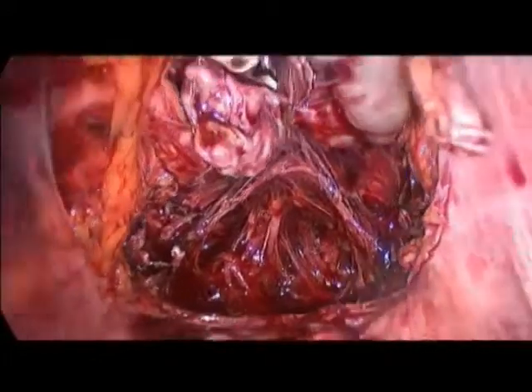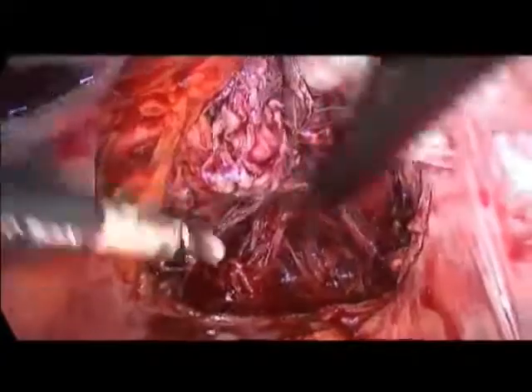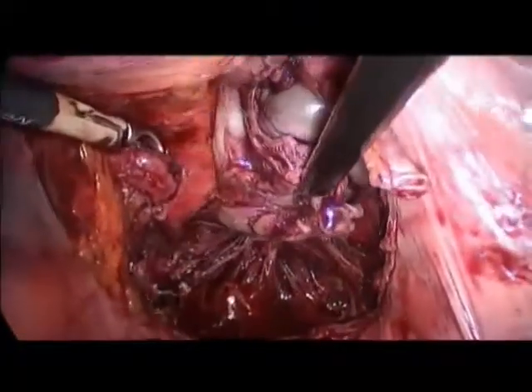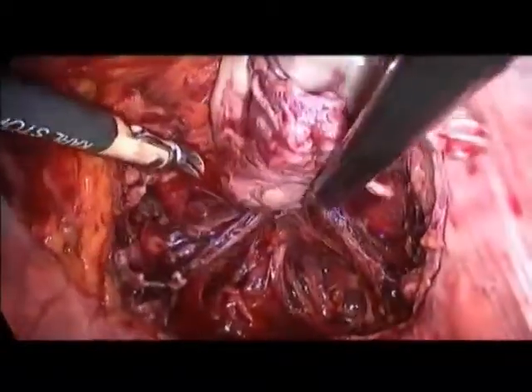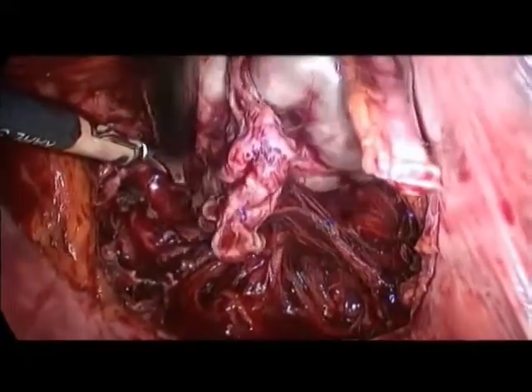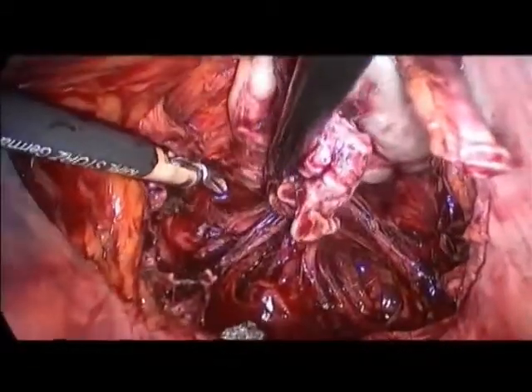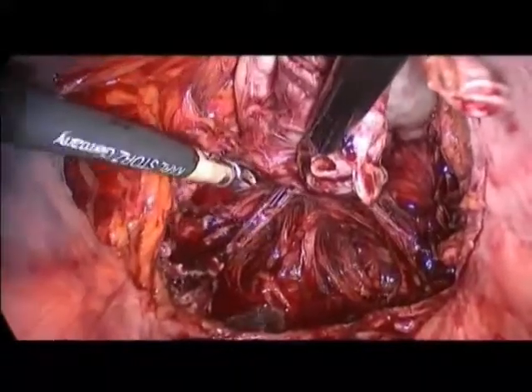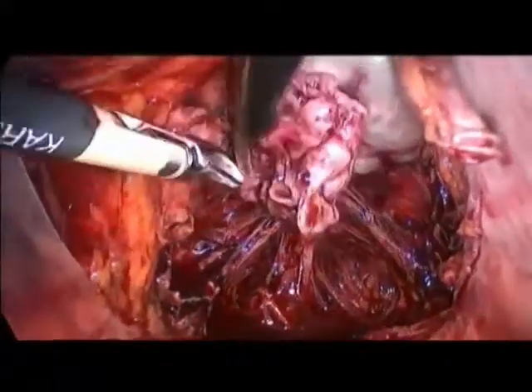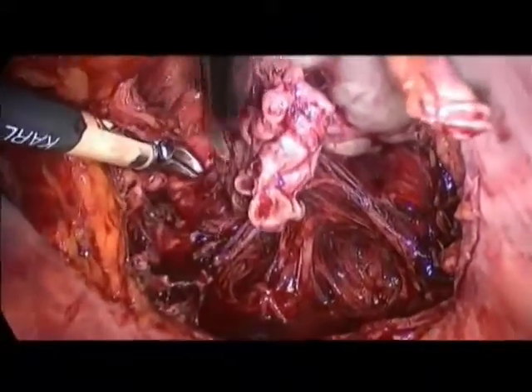Roland? Okay, we have completed the dissection of the seminal crossroad, as you can see. We don't insist too much on the edge between the seminals and the base of the prostate because it is not necessary for the dissection. The specimen will be complete enough even if we do not open these areas. And this is another way to reduce the risk for margins with lesions present at the base of the prostate.